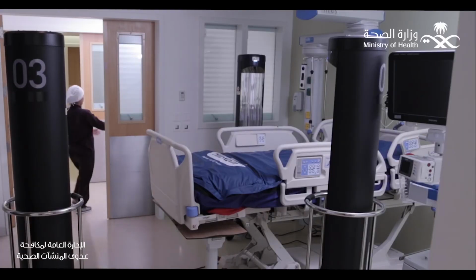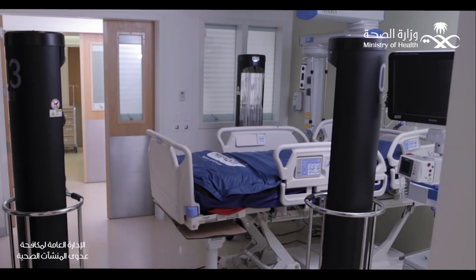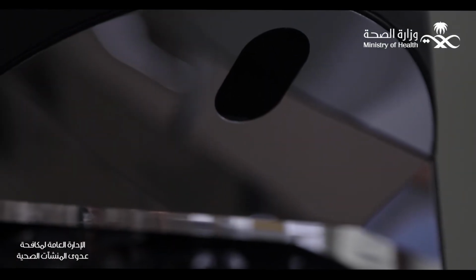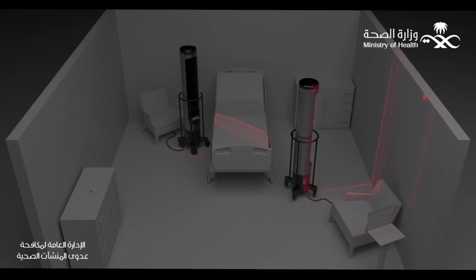She starts the process of activating the device through her own tablet device, which makes the process of ultraviolet disinfection easy and comfortable for the healthcare worker and protection for her during disinfection. After adjusting the settings for the device, the healthcare worker comes out, tightly closing the door behind her. The device starts working according to the specified period of time through the special electronic scanning in the device.